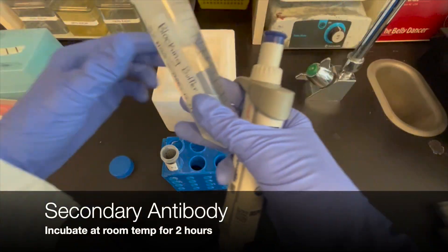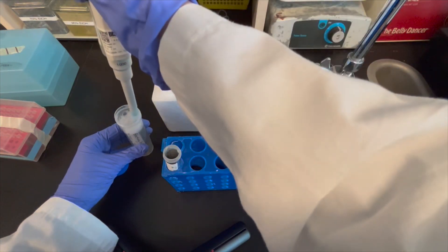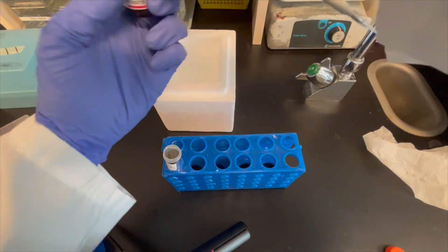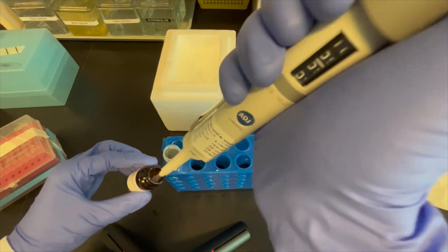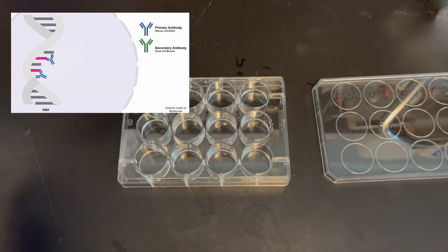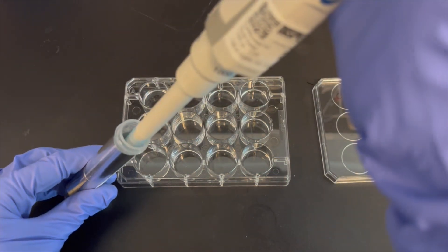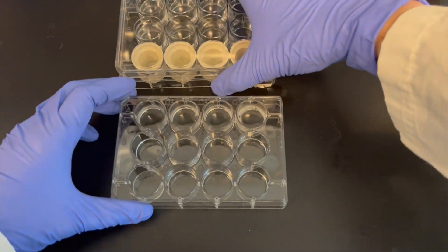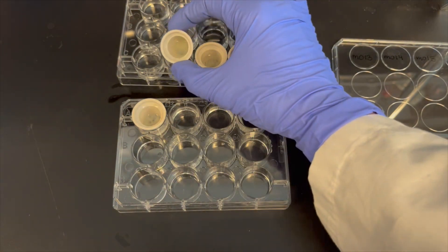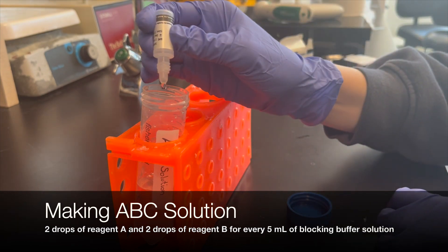Move tissue to the secondary antibody solution and let it incubate at room temperature while shaking for 2 hours. The secondary antibodies will bind to the constant domain of the primary antibodies, which are already bound to BRDU. Transfer the tissue into the secondary antibody solution. During these steps, make the avidin biotin complex solution.